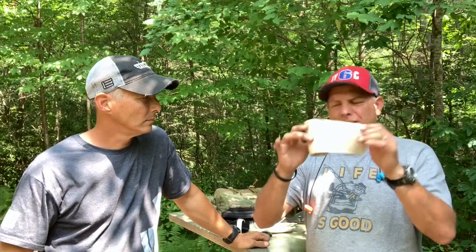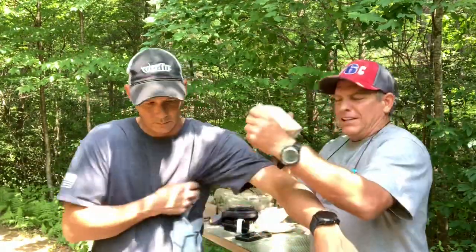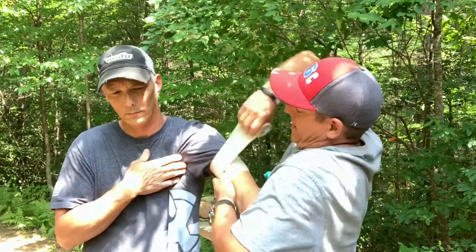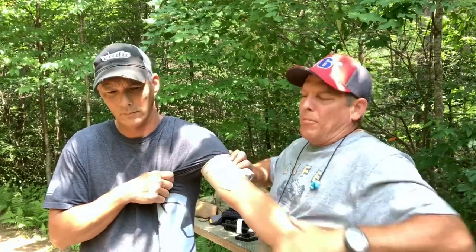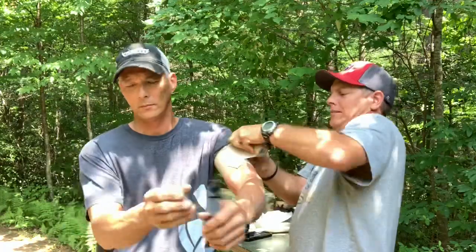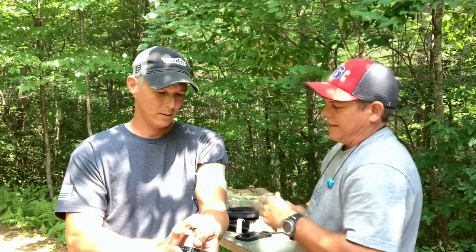But what I want to know is, let's see if we can turn this into a tourniquet. So let's see if we can utilize this. I'm going to go ahead and try to stop his bleeding. What's nice about this is it kind of sticks to itself and holds itself. So 5 yards, I know that this has been in my bag a long time. I'll go a couple more rounds. Let's see. Nowhere near a CAT tourniquet right now. And he's working it pretty darn tight. And it ripped. And it stayed.